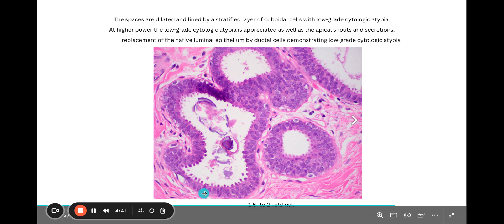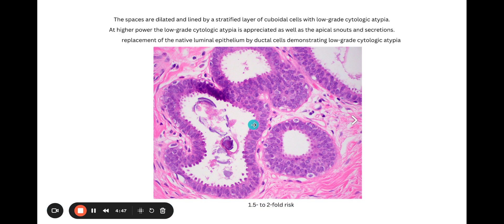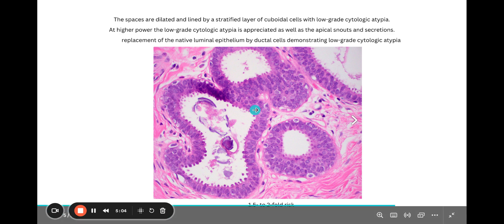And then if we look over here, we have nice columnar cell change, which you can appreciate. And you can also see prominent nucleoli. So there is certainly atypia present. We have replacement of the normal native luminal cells with this columnar cell change — these columnar cells. That's the important finding for FEA.